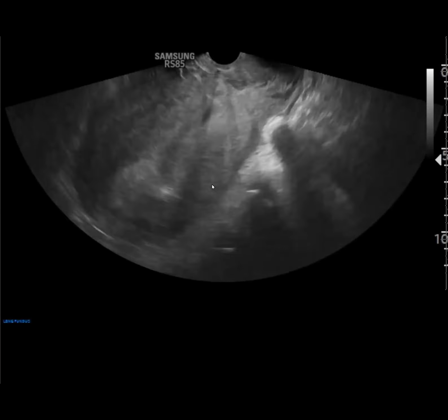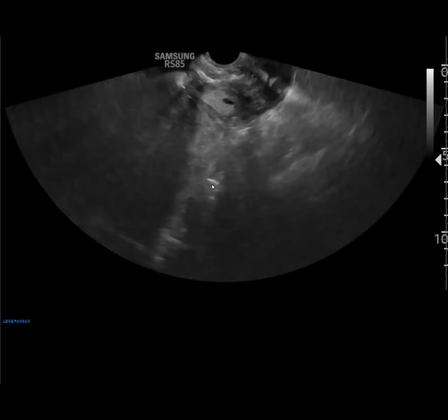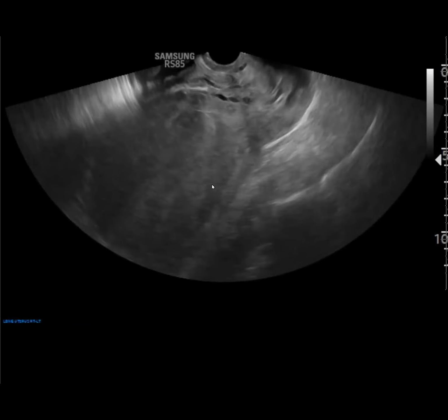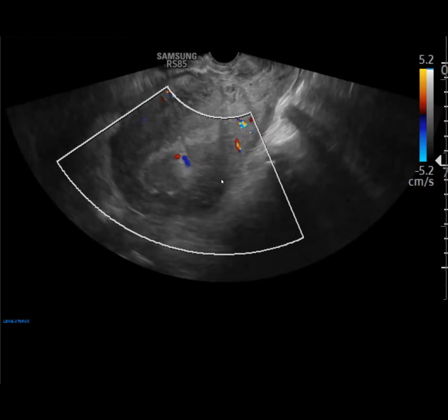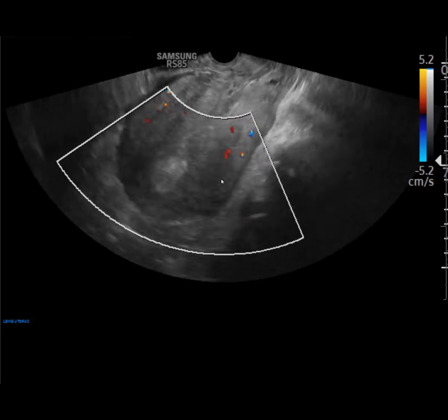Wait, Steve, I need some crucial imaging on this, which is the color Doppler imaging, because we're wondering about retained products, or is this just blood? Okay, wait. So I see flow in there and it looks maybe like true flow. I want some Doppler on that.